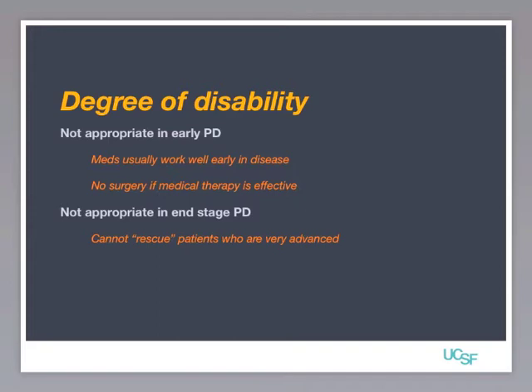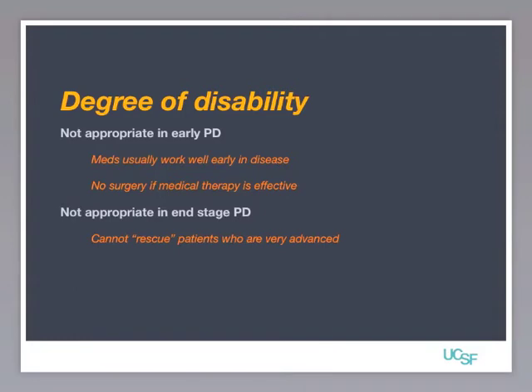I'd rather have this fancy electronic thing. And we are sort of rethinking, and there are people actually studying, is it okay or desirable to intervene with DBS earlier in the disease course? But for someone who comes in, they're not having dyskinesias, their medications are controlling their symptoms throughout the entire day, we generally will counsel them to wait. Now, why do we do that? Technology is changing all the time. These devices are getting smarter. The ways that we implant these devices are getting more sophisticated. The batteries that drive these systems are constantly getting upgraded. And so it's kind of like buying a computer. If you wait a little bit, you can often get the next best thing, or we learn more about how best to treat people with DBS. So there's advantage, if you're early on, to waiting.